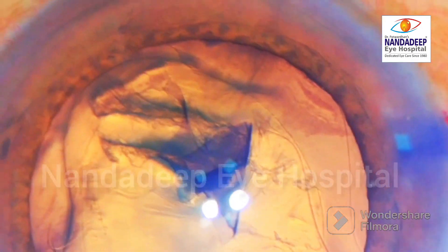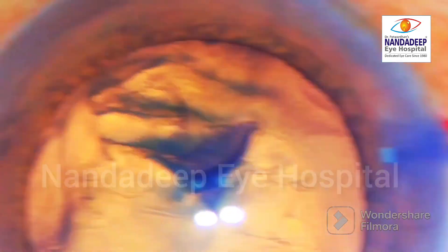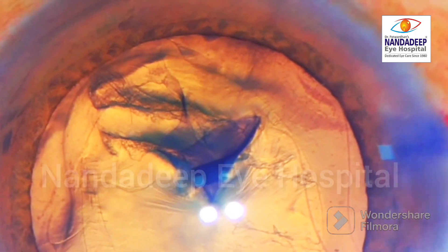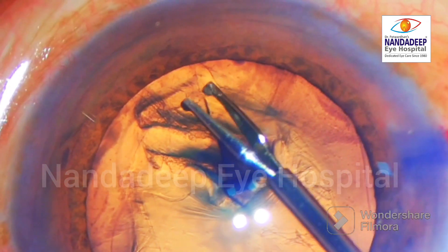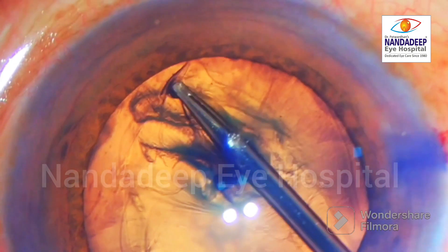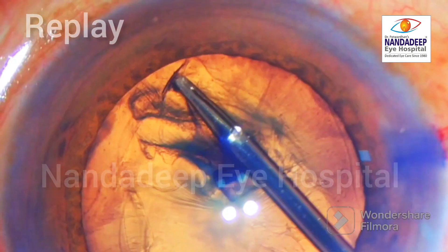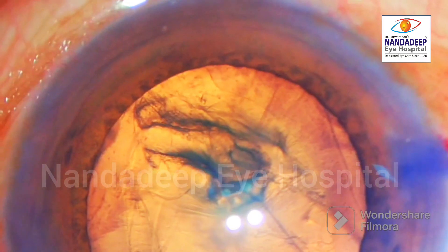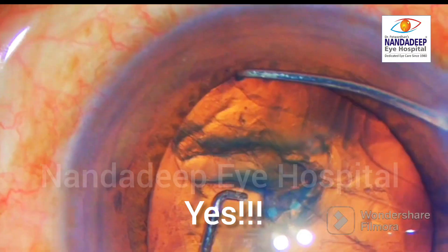Now we are going to do a quick pull maneuver using the microcapsule rexis forceps. The rexis forceps must have a good hold over this tear. You can see that the tear is being held properly and then a quick pull in the central direction is given. It is quite quick, and the most common problem that surgeons face is that they are hesitant to pull it quickly.